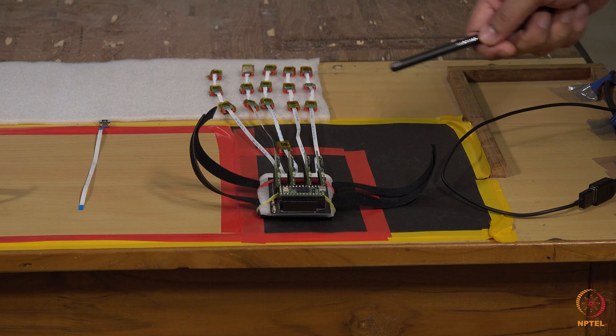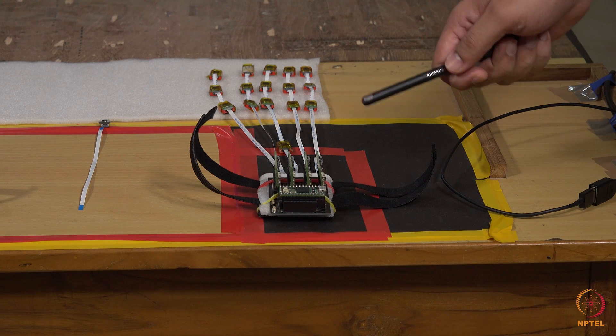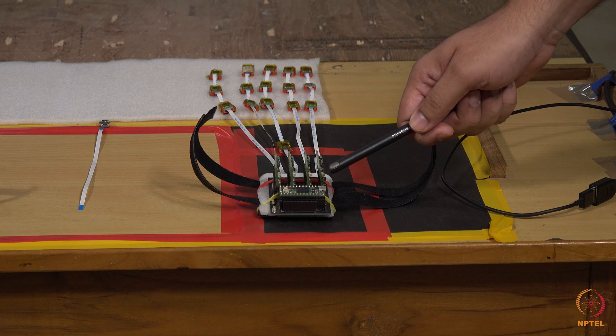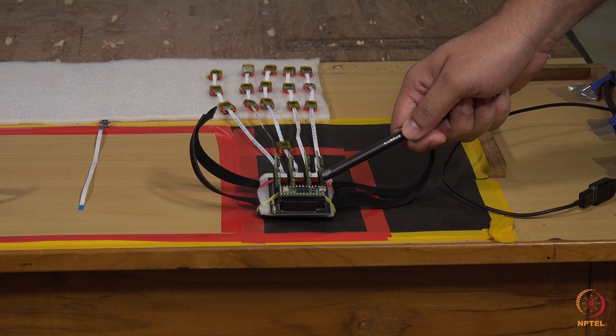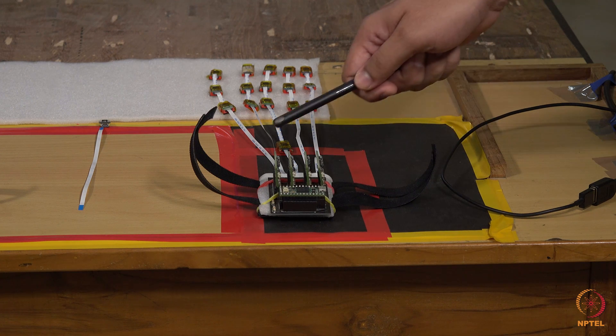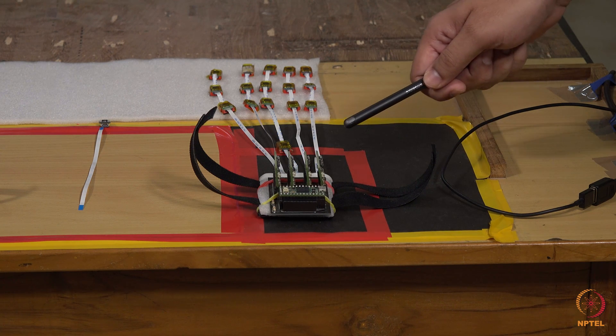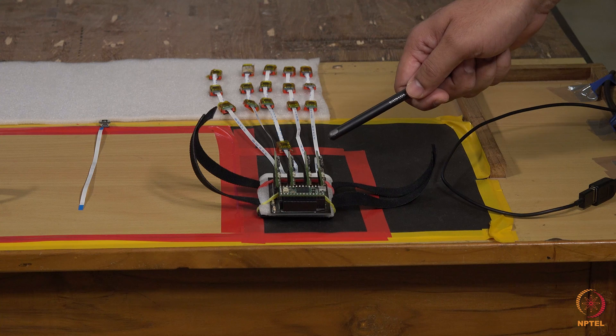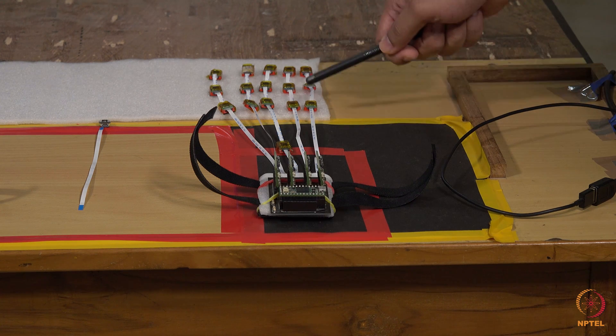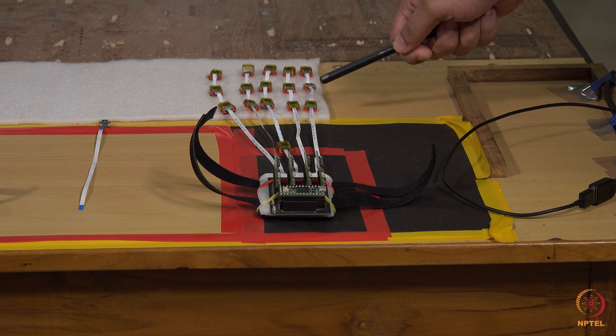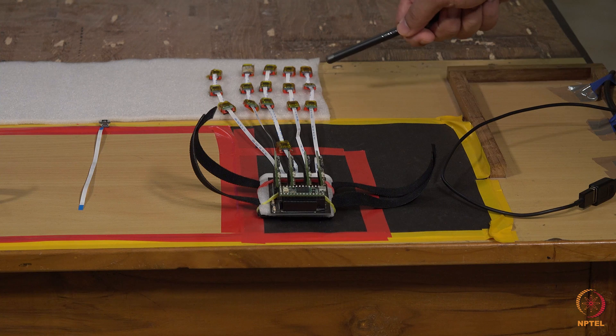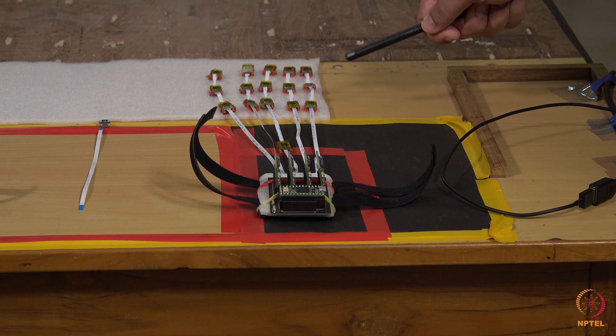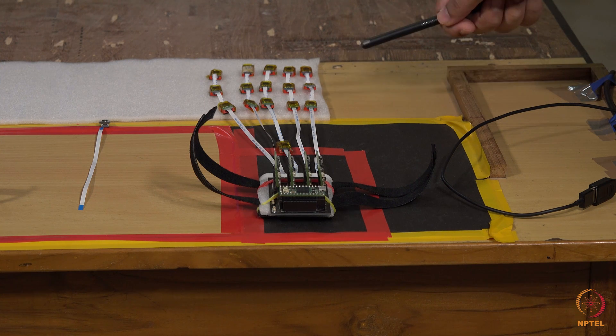the hand kinematic measurement system consists of five microcontrollers connected in the master-slave configuration. This master-slave arrangement was designed in order to output orientation data from all the 16 IMU sensors at a rate of 100 hertz. This is a zoomed-in version of the HKMS device. It consists of the master microcontroller here and the four slaves. Each slave is connected to three IMU sensors connected in series and these three IMU sensors are connected to individual finger phalanges of a single finger.